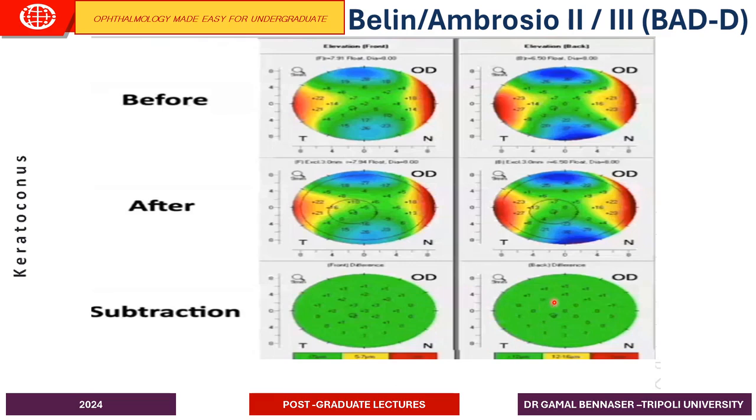The other thing is that we study the cornea after applying the enhanced reference surface, so that we amplify any minor irregularities in the cornea using this technique, which is generated by the computer after exclusion of the central 3 to 4 millimeters of the cornea.